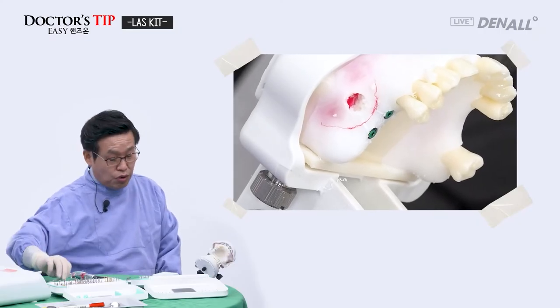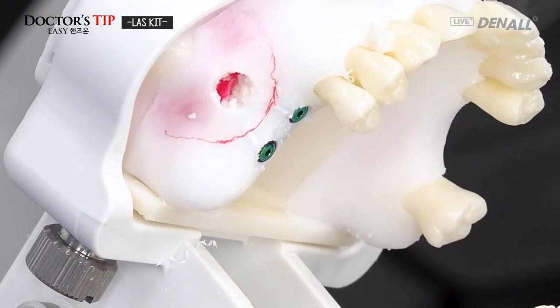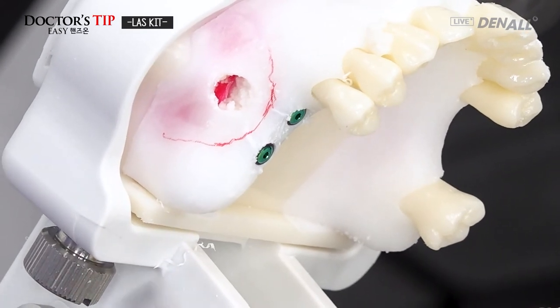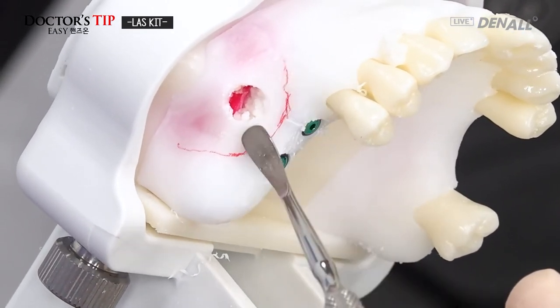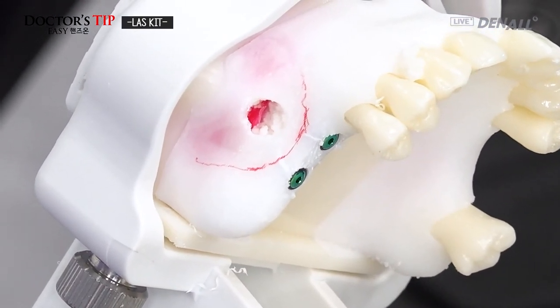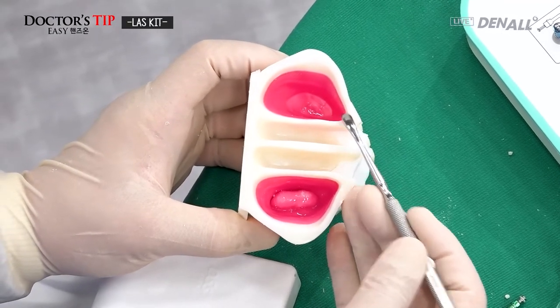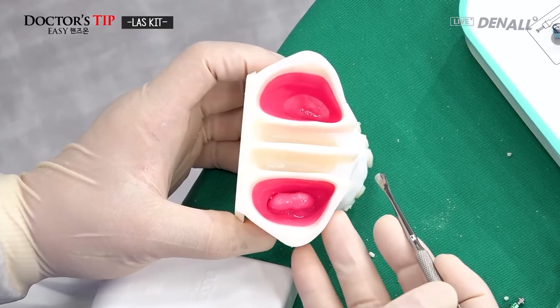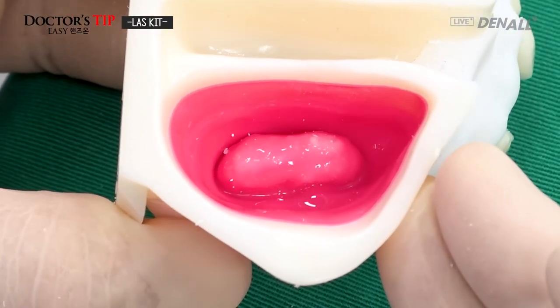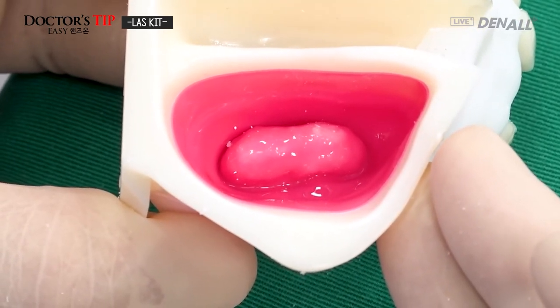We used the dome drill, so we ground the window, and there's no need for repositioning the window. So you can just suture, cover up like this, or you could first cover it with collagen membrane. And that's it. So this is how it's completed. So compare the sinus. You see, on this side, the membrane has been fully elevated, and you can confirm that bone grafting and implant placement have been done.